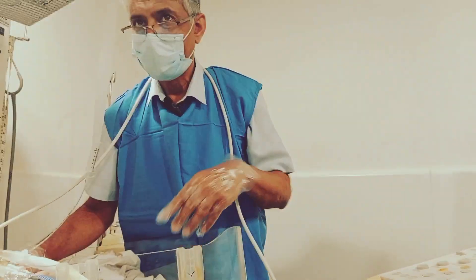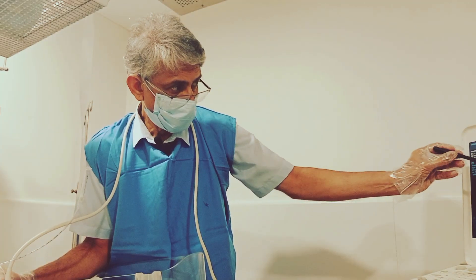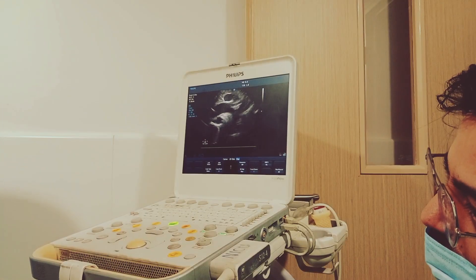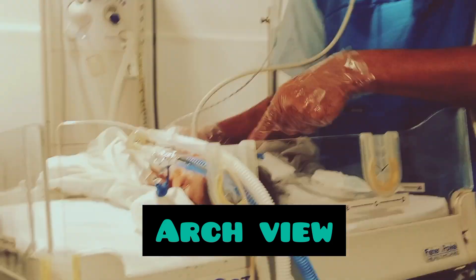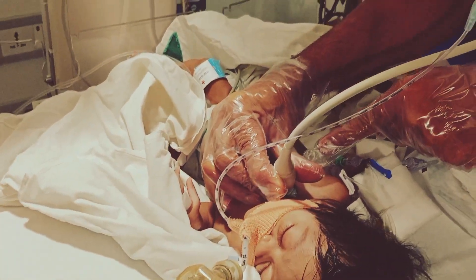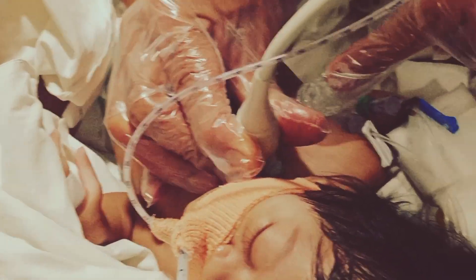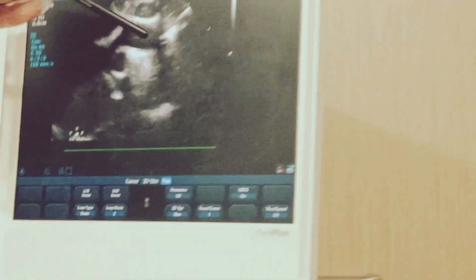Now, to understand where exactly in the airway the tube sits is very important. For that, this is the arch view I have taken. I have kept the footprint probe in the suprasternal space in a sagittal frame, marker facing up. When I do that, I get this shadow — this is the arch view.